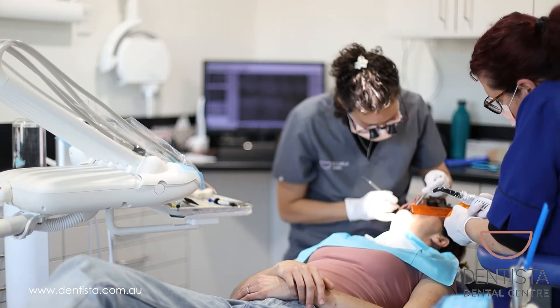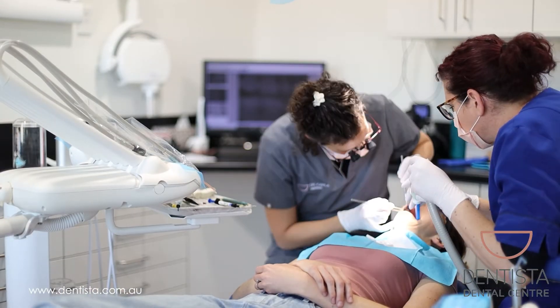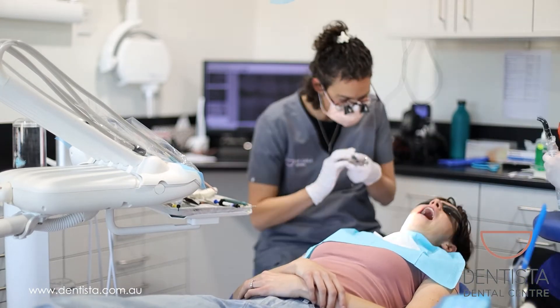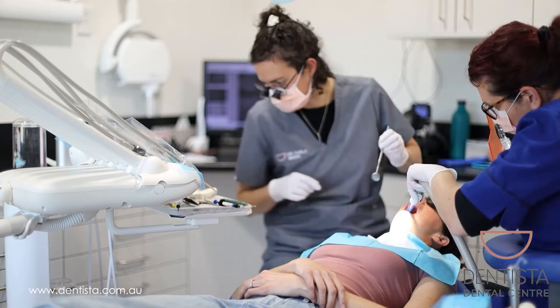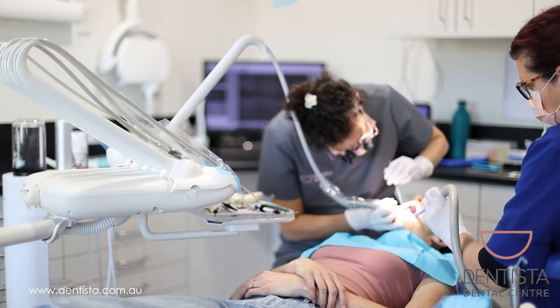We use the blue light, which is blue from the white light spectrum, to activate the filling material so it sets really nice and hard. You can see we've got that orange paddle there — that's just to protect our eyes because the blue light is very intense.